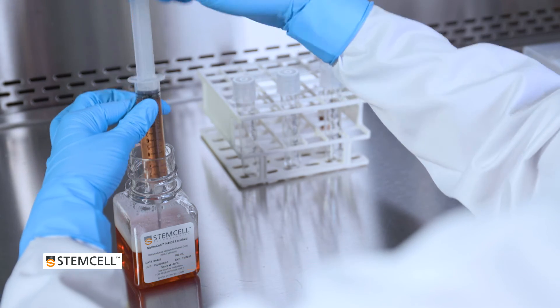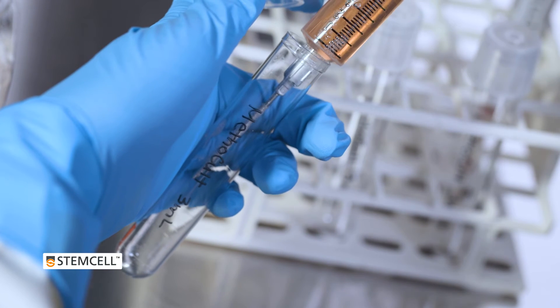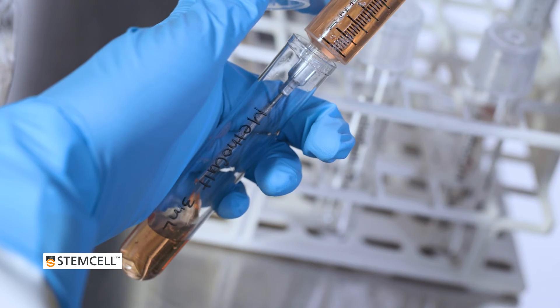Do not use a pipette. Methylcellulose medium is viscous and will stick to the inside of the pipette, causing the dispensed volume to be inaccurate.